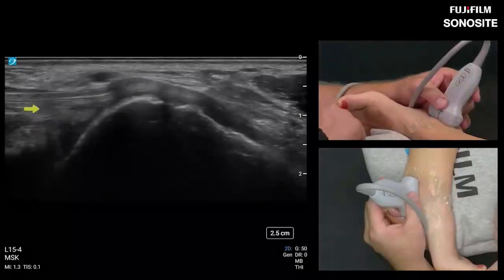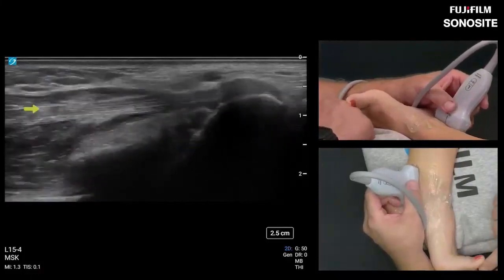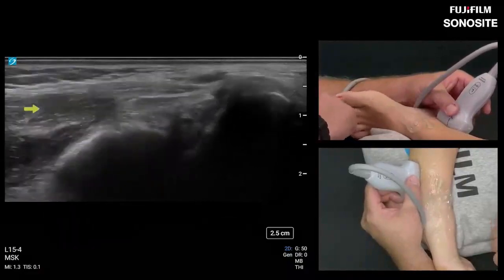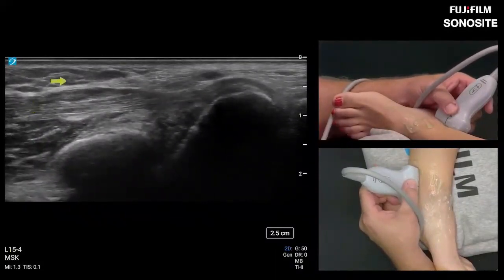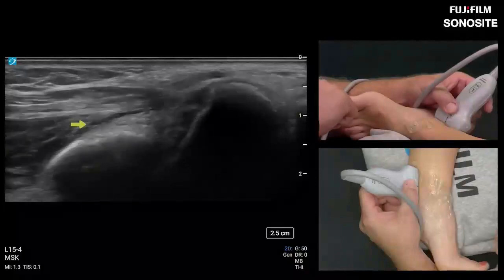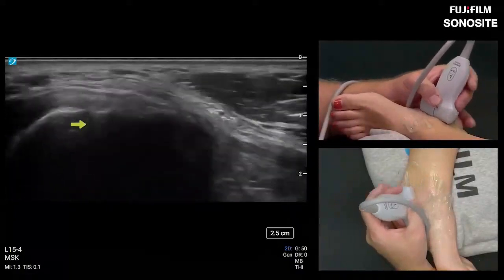Very easy to see it move, but you can see that distal musculotendinous portion try to pull its way down into its own little tunnel. And you just don't want to call that tenosynovitis. You don't want to call it a joint effusion. If you're holding real still and on a lesser quality ultrasound machine, it may appear that this is all fluid and not muscle. See if that fluid moves with the big toe tendon, right? And if that does move with the tendon, then it's probably just the distal musculotendinous portion.